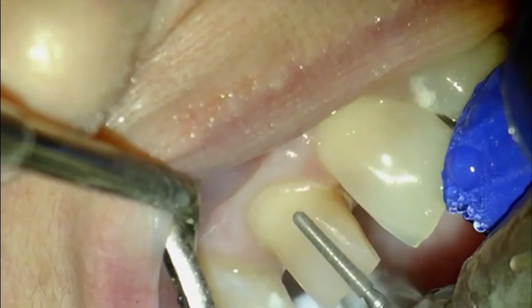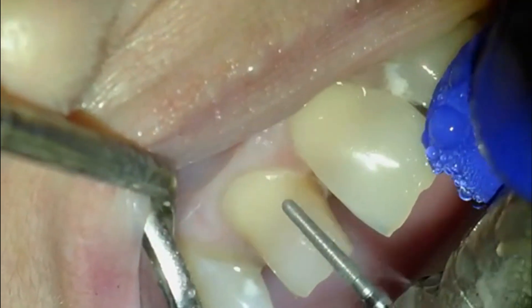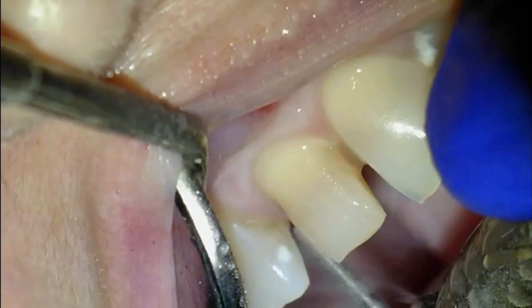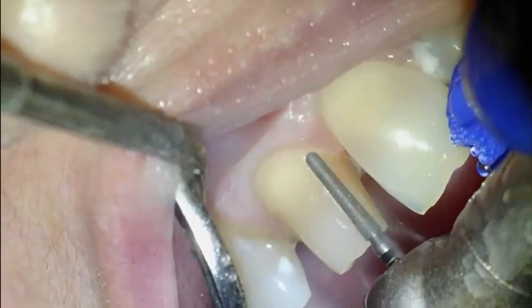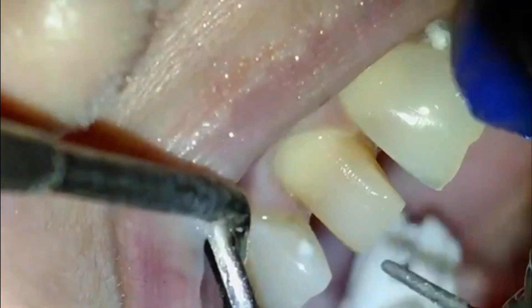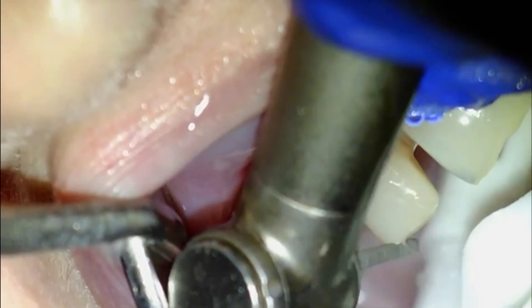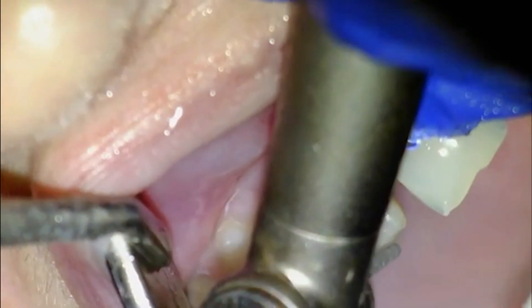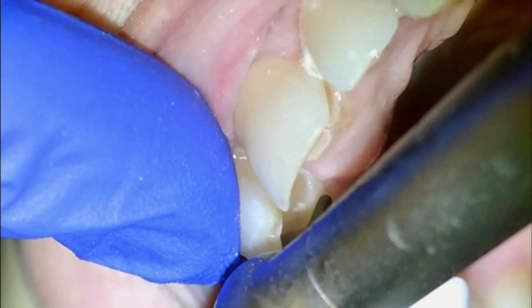We've also instructed the lab to open her bite about a half a millimeter on her molars. If you open up the bite a half a millimeter on the molars, that will translate to about a millimeter and a half opening in most cases. However, the way this patient bites is such that opening her up about a half a millimeter on the back will only really open up about a millimeter on the front. When doing that, it's very important to take into account that you're changing this person's bite — they've had this bite for decades and are very comfortable with it. That's another reason we're going to be making the temps.